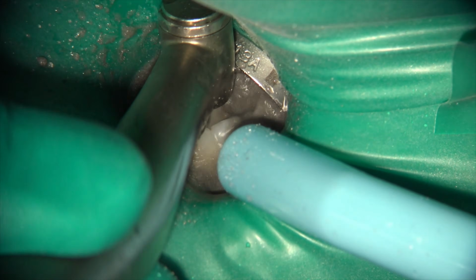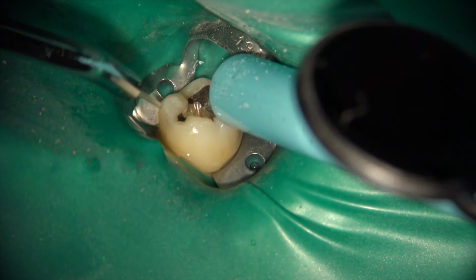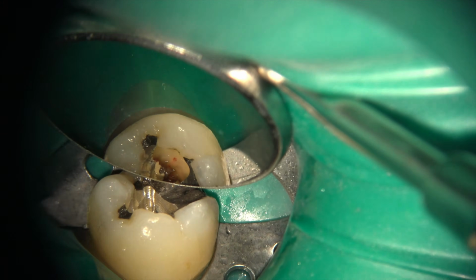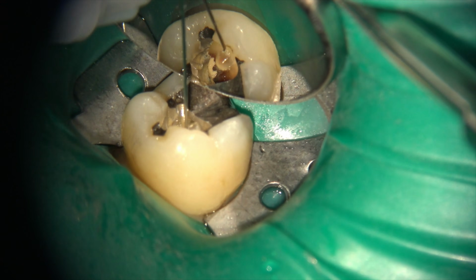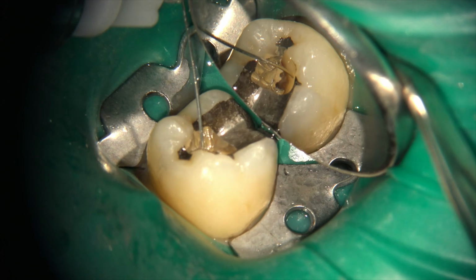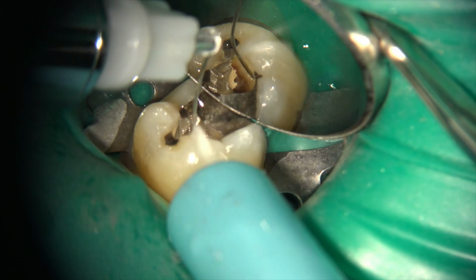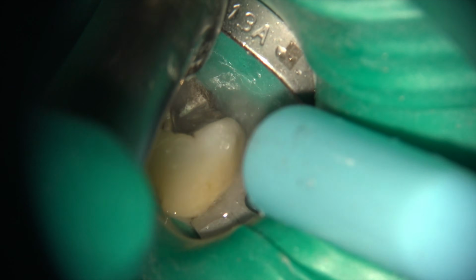Anyway, here we do access through the amalgam preparation that's on top of the tooth, and then you rinse out any of the debris that's in there, and the access is done in such a way that, as you saw here, I can get that pinpoint exposure into the pulp horn. The key here is to make sure the diameter of the opening is just the diameter of your needle, so that there is no backflow, so that all the anesthetic creates that pressure inside that can create immediate anesthesia.